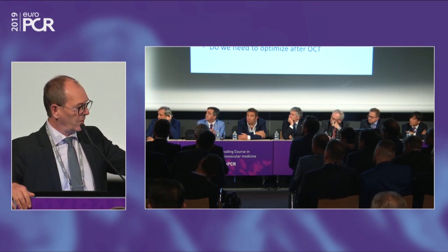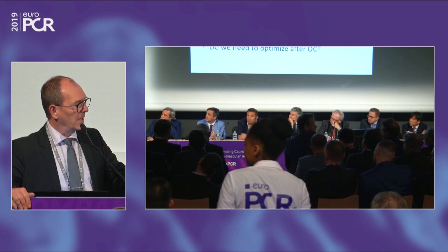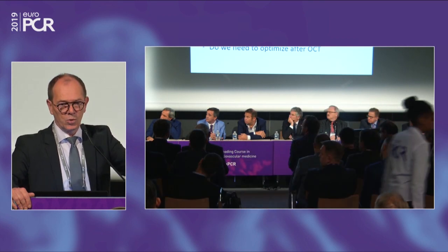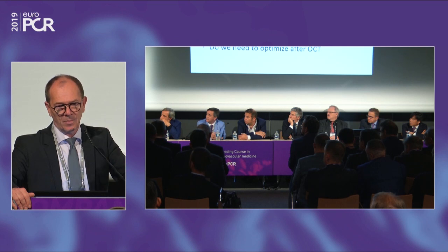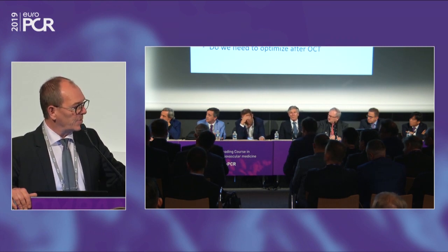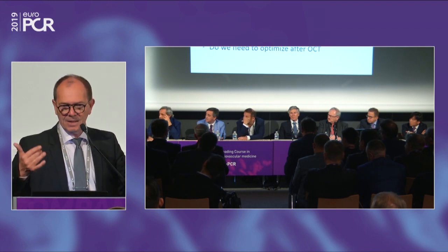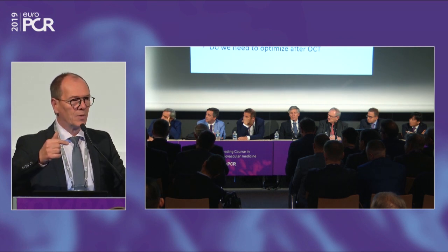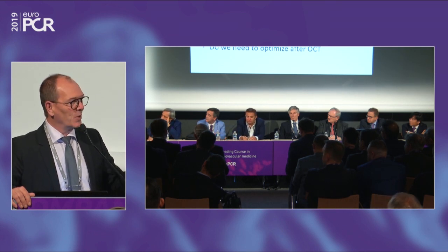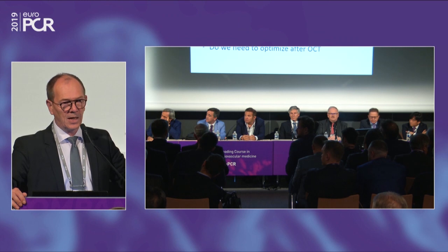So that was the way Thierry and other French guys, especially Yves Louvard if I remember well, proposed to treat with a tubular stent from the ostia to the distal part to prevent restenosis and dissection at the ostial part of the left main or just in front of the stent. See the story of the technique, the tips and tricks of the bifurcation. So with this stent, if you don't perform a kiss, or if you make a light kiss, if you don't want to increase too much, or if you close your procedure with a final POT, you prevent this abnormal deformation, and you prevent the dissection at the beginning of the stent.